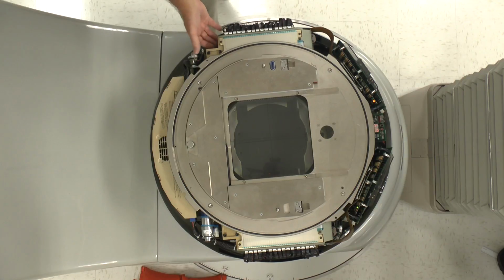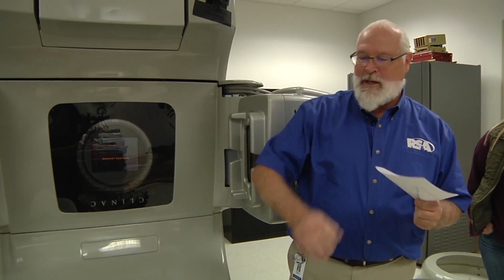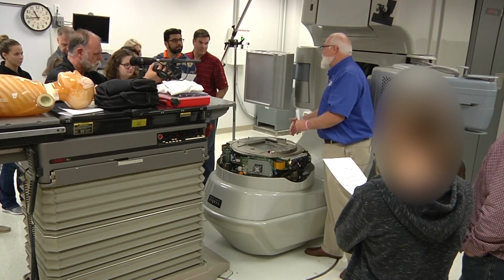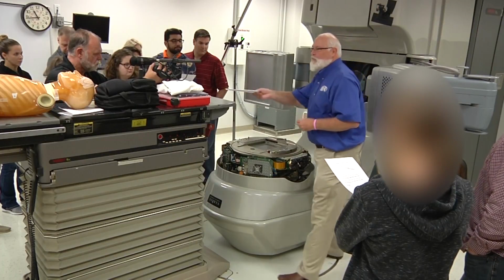If it's on the bottom one, that means someone has to physically pull the carriage off and put it on the table. This weighs about 80 pounds. So we won't ask you to do that. So that's why we'll always ask you lots of questions over the phone. That tells me how far I can have you dig into the machine to look at it.